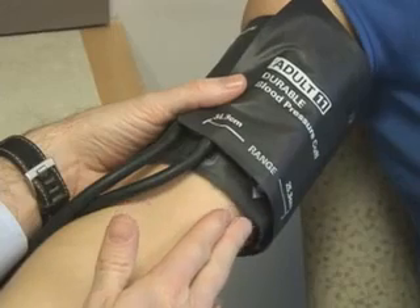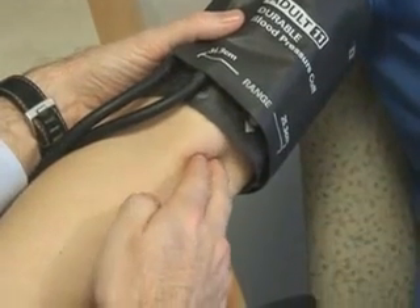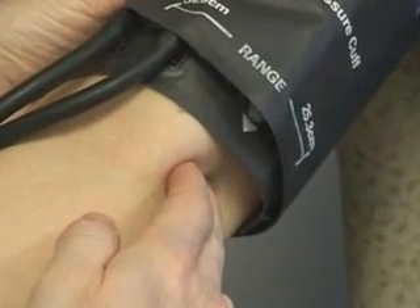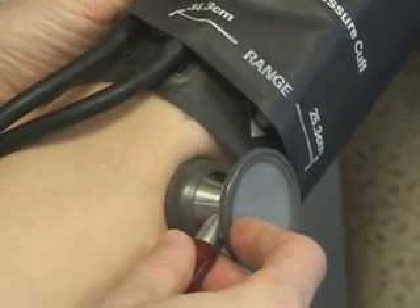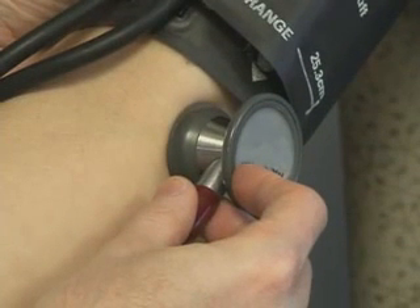Find the brachial artery, which is palpable approximately four to five centimeters from the medial epicondyle on the anterior surface of the elbow. Place the stethoscope lightly against the skin over the brachial artery with appropriate pressure to ensure good sound transmission. The stethoscope should not be in contact with clothing or with the cuff.